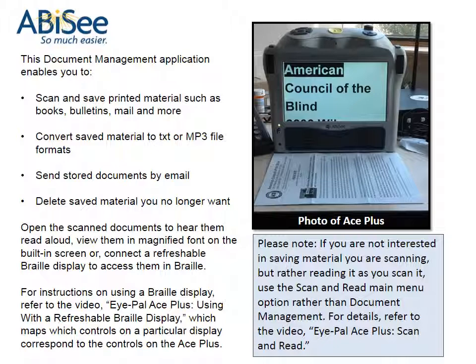For instructions on using a braille display, refer to the video iPal Ace Plus: Using with a Refreshable Braille Display, which maps which controls on a particular display correspond to the controls on the Ace Plus.